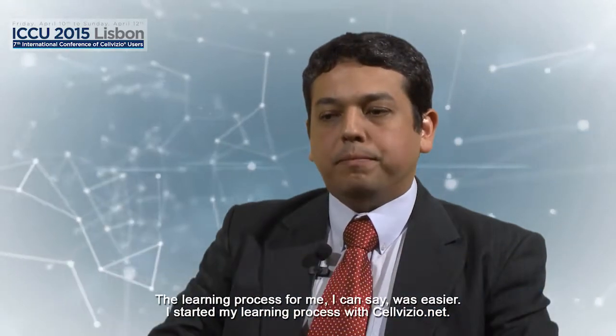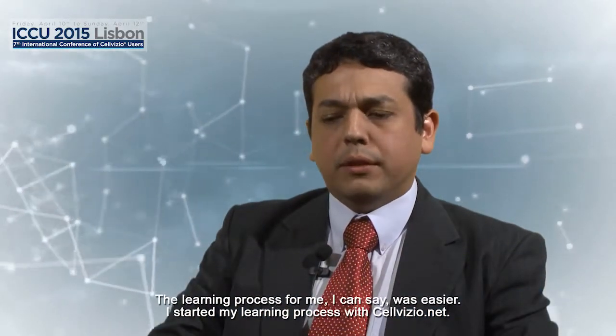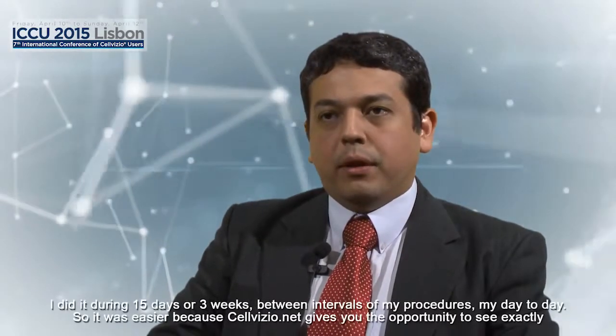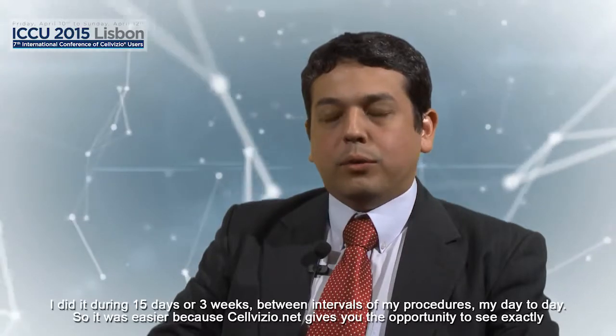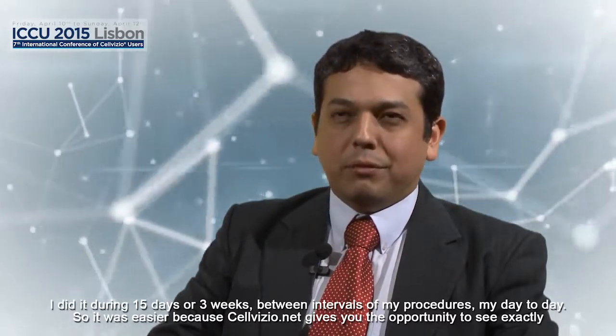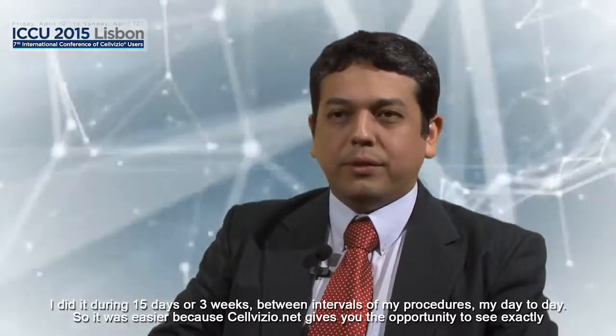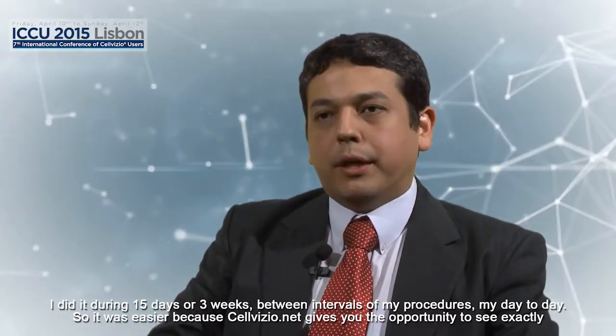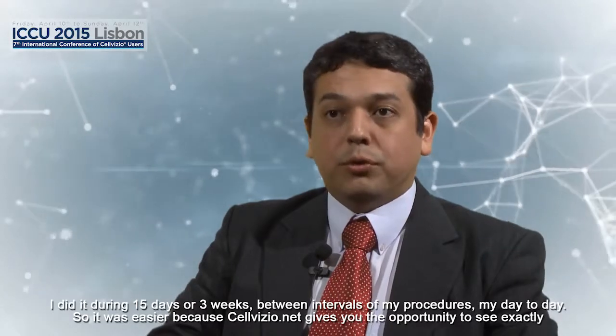The learning process for me was, I can say, easier. I started my learning process with Cellvizio.net, and I did it during 15 days or 3 weeks, in between intervals of my procedures in my day-to-day.